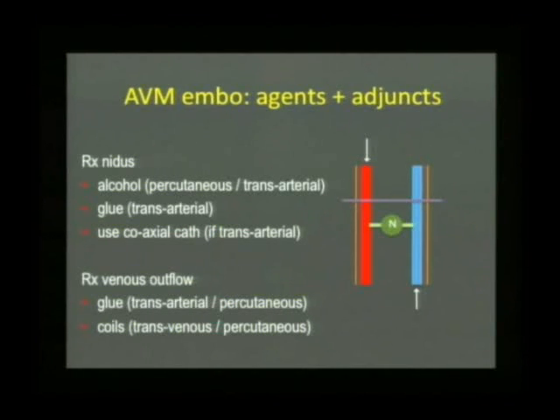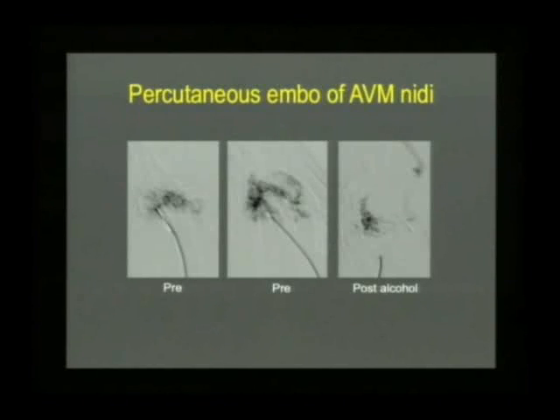During the embolizations, and always, if you're using a catheter to do any transarterial work, I don't mean a diagnostic study, but actually doing any embolizations, injecting alcohol and glue, you need to use microcatheters with a coaxial technique, really.